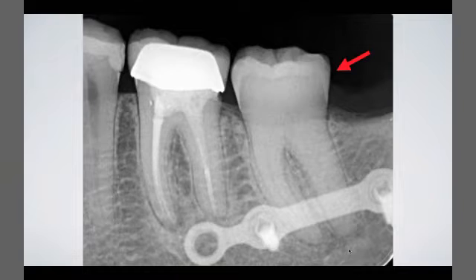This patient came to me with a slight pain on the lower left region. He said, "I have a slight pain in this area, and I don't know which tooth exactly." So I did my examination. I took the periapical X-ray. I couldn't find any periapical pathology. I did the percussion test. Nothing is clear between the 6 and 7.